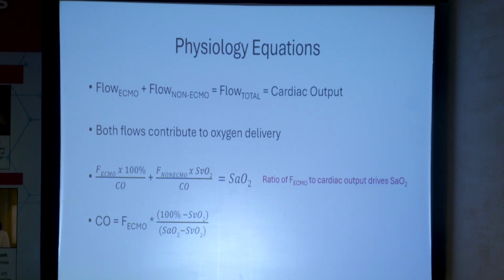And you can derive that equation on the third line, and you can rearrange that to get a relationship between cardiac output, ECMO flow, and your venous saturations.